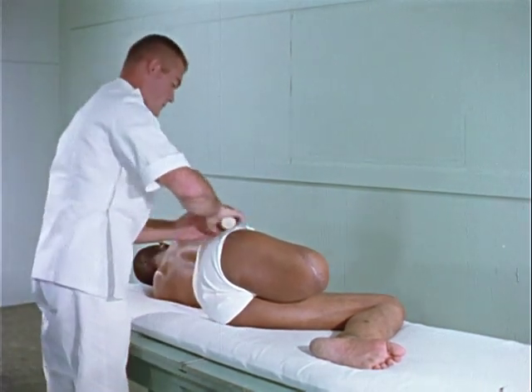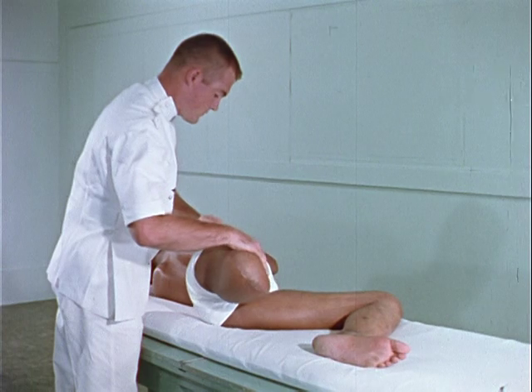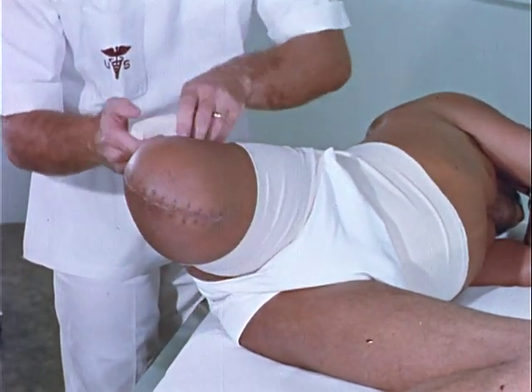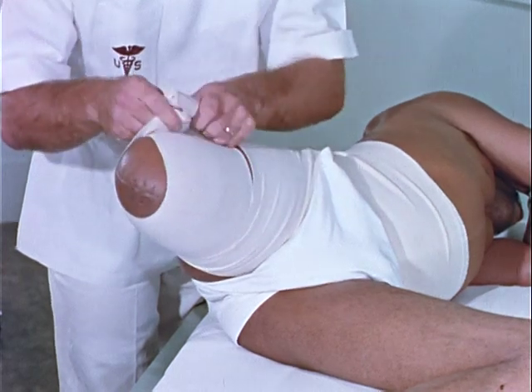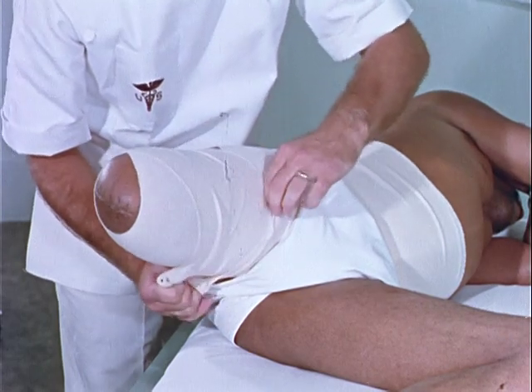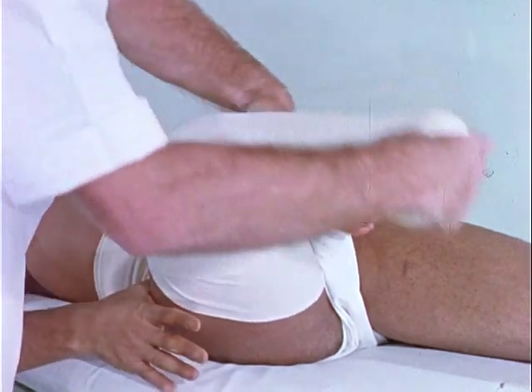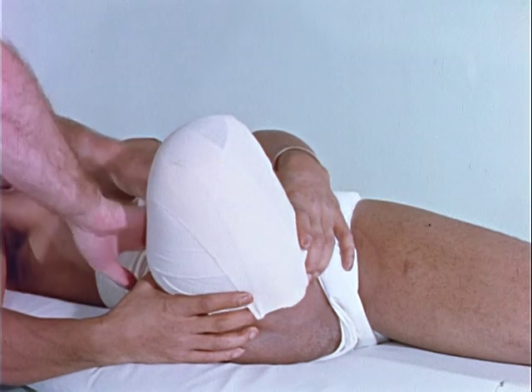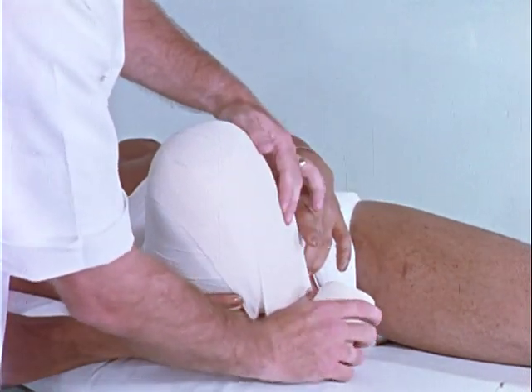For the above-knee amputee, the side-lying position allows the stump to be wrapped in extension to aid in preventing a hip flexion contracture. A six-inch bandage is anchored about the waist, providing a base for additional bandages. Two four-inch bandages with recurrent and spiral turns are used to shape the stump. Firm pressure is applied throughout the process with slightly more pressure exerted distally than proximally.